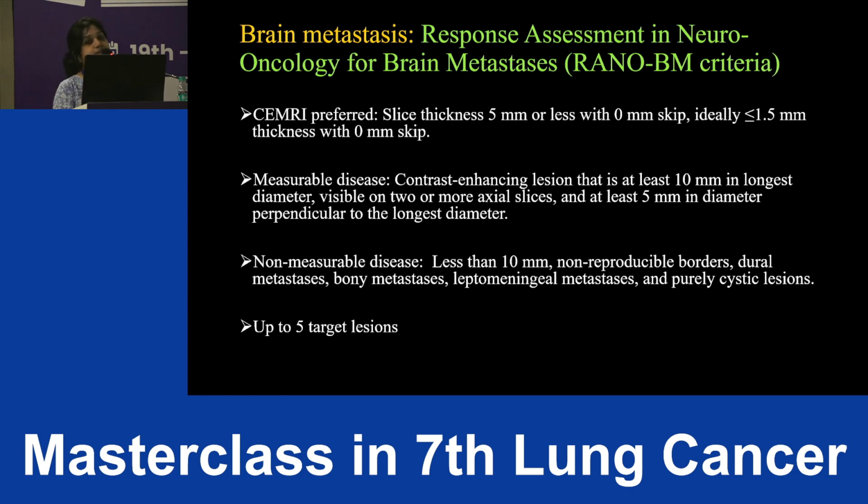Now coming to brain metastasis. How do we assess response in brain metastasis? We use response assessment in neuro-oncology for brain metastasis, that is the RANO-BM criteria, for assessing response. How is it different from RECIST?